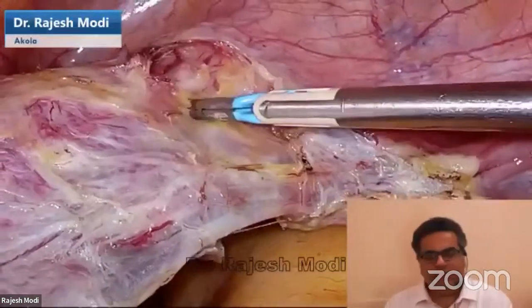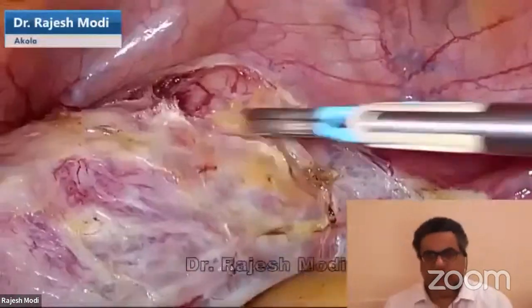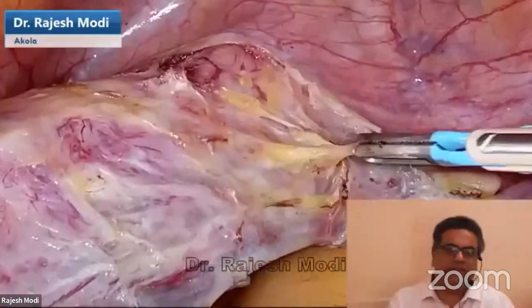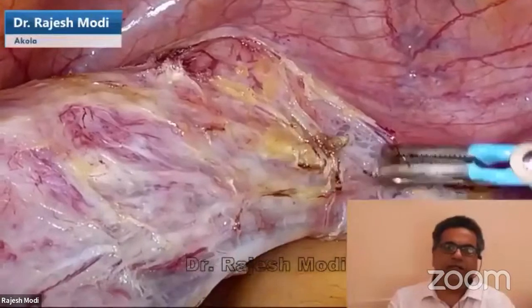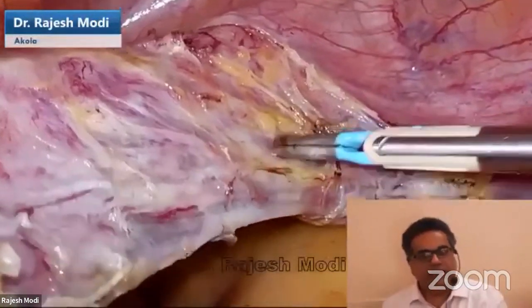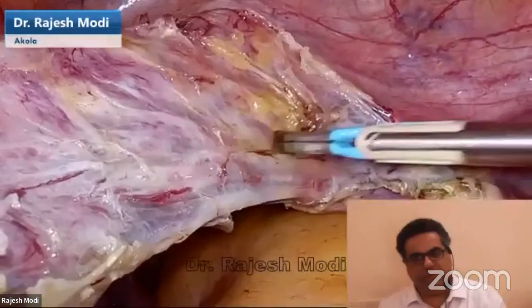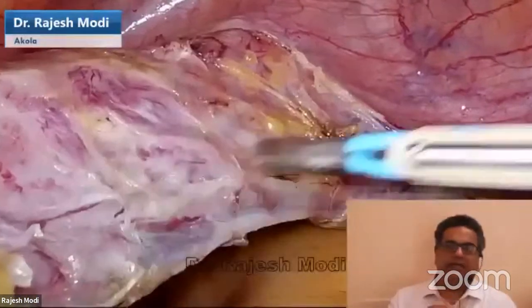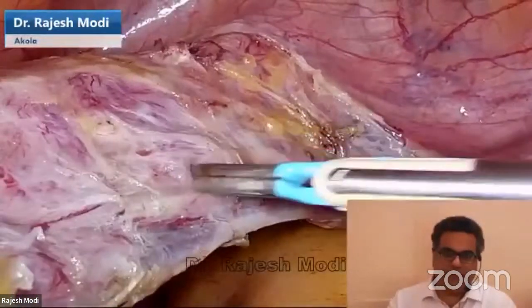The moment you have the bladder pillar part going down, the uterine transverse part pops up. It identifies itself completely, and the ureter will always be below and lateral to that point. So as long as you are staying above the transverse part, as long as you're not coagulating on the transverse part, you will never, ever damage the ureter.